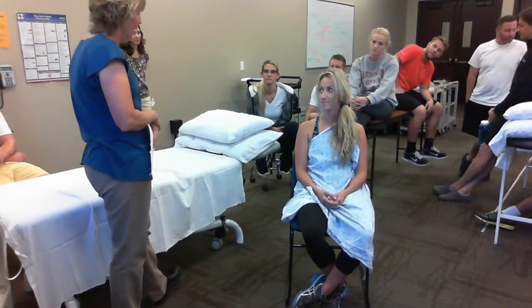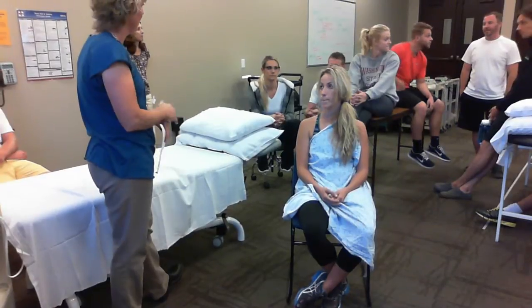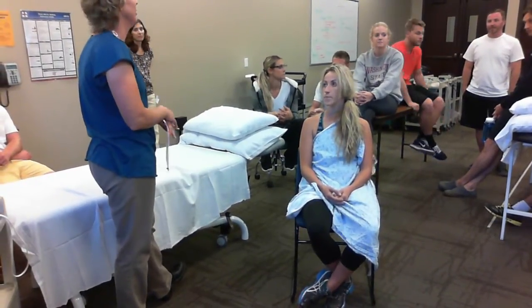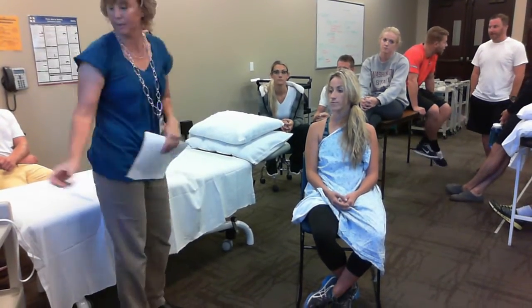Yes. Excellent. And we operate on a call bell system, so if at any time you're experiencing something I haven't explained, you're uncomfortable or in any pain, or just a question that you may have for me, I want you to ring this call bell.